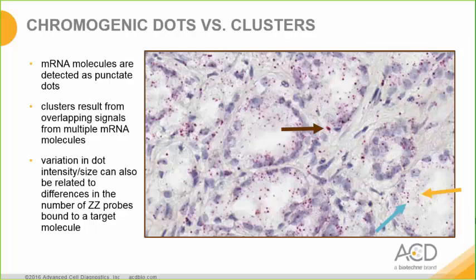The small faint dot pointed by the orange arrow is one RNA molecule. The slightly larger, darker red dot, which is also very nicely round, pointed by the teal arrow, is also one mRNA molecule. However, its larger size is due to more double-Z probes bound to the target molecule. In contrast, a cluster pointed by the brown arrow is more oblong with a slightly irregular border and results from overlapping signals from multiple mRNA molecules.